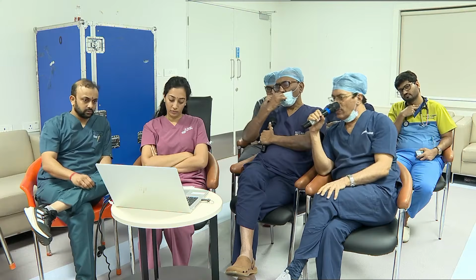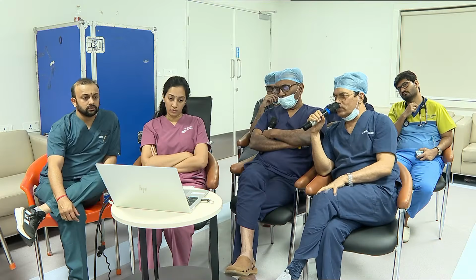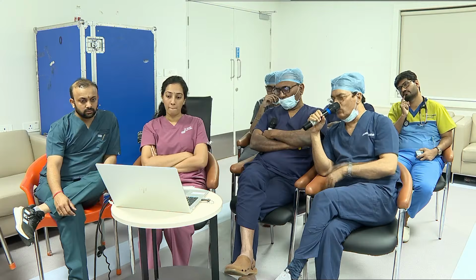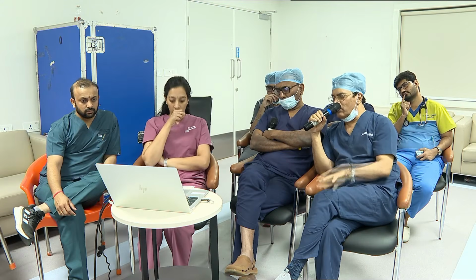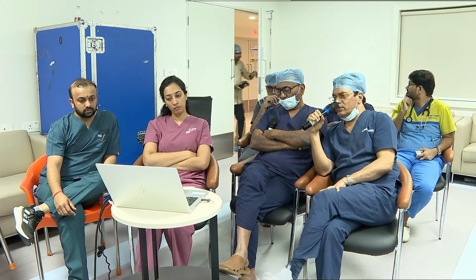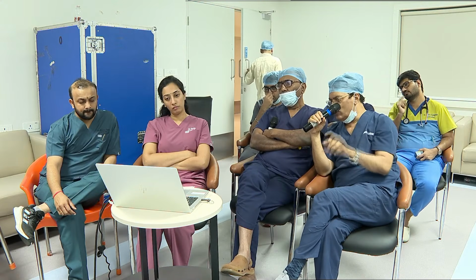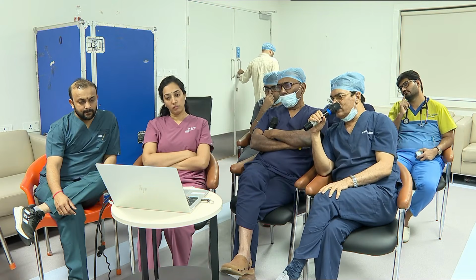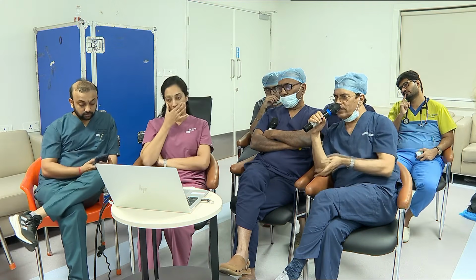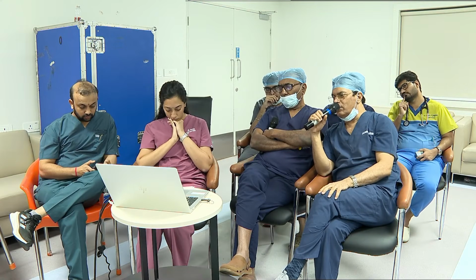So here he has shown some of the challenges. You see, even veins are tortuous. So we were forced to use a long sheath. That is very important. Otherwise, if you only push the pacemaker and try manipulation, one is wasting the time, another is it may lead to perforations. The approach is also very good, because here, when do you want to flex the device? That is very important. When you reach the ascending aorta, flex, then go there. Once you reach there, after placing, unflex. These are all important.